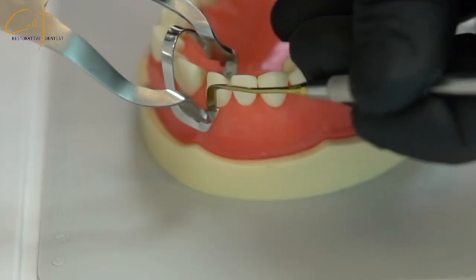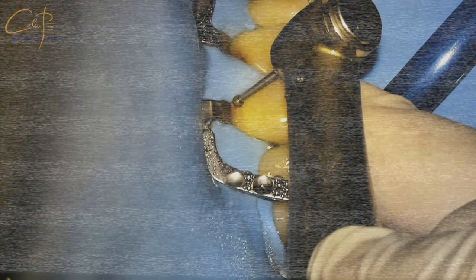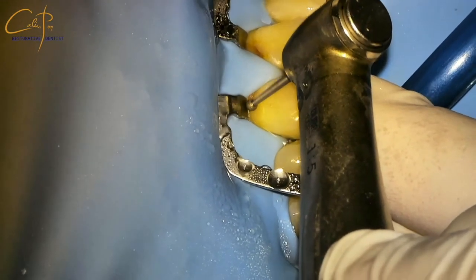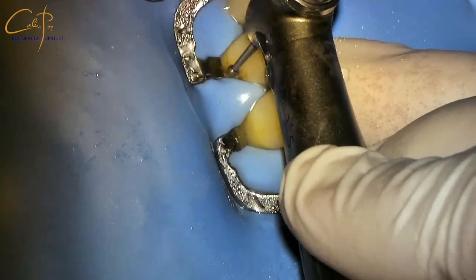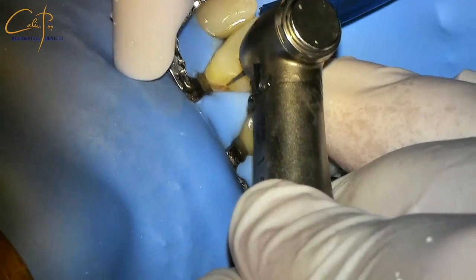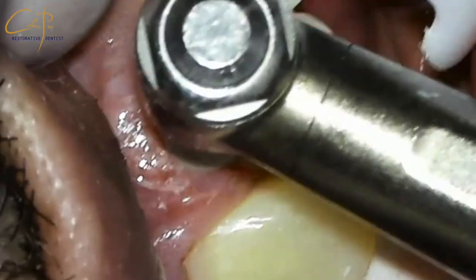I push the buccal beak into a deeper position while not losing the position of the palatal beak. My favorite everyday long shank bur starts removing the decay, eventually switching to a sharper one once I get close to the sheet, just to prevent tearing it. Then the final polish with your favorite system, last cure under glycerin, and the case is finished.